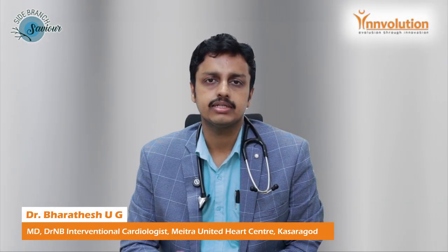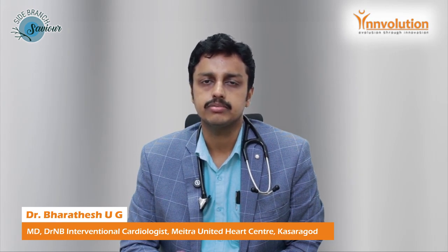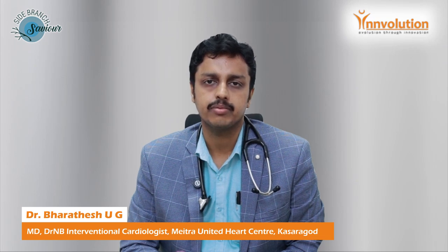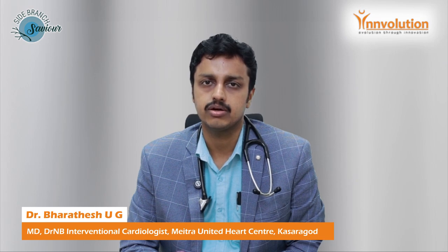I prefer an open cell design with the 6 crown valley-to-valley design, which helps in good side branch access and good tracking of the stent through the side branch. In a closed cell design, it prevents the stent crossing and also the trackability. You may have to push it a lot harder, and that may cause stent damage.